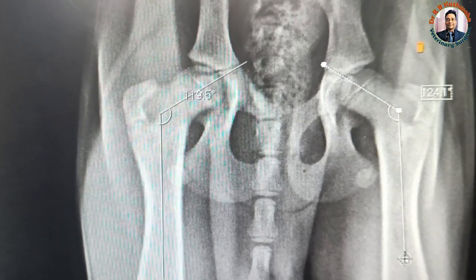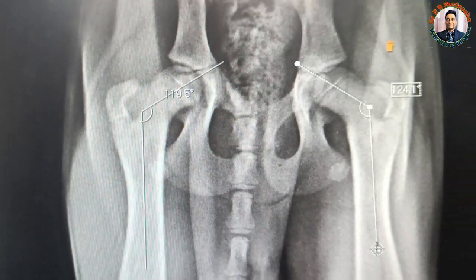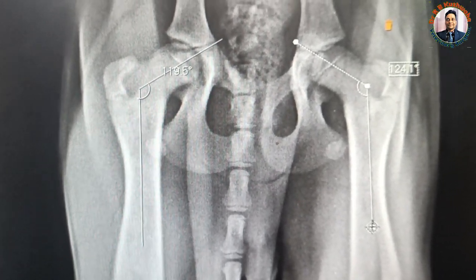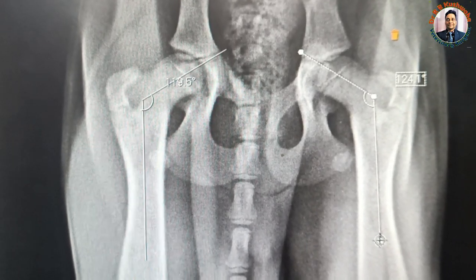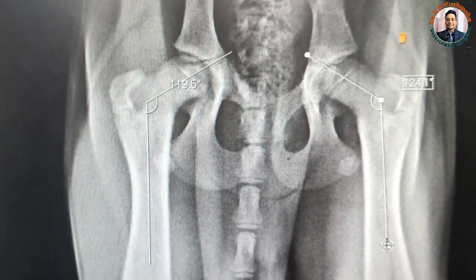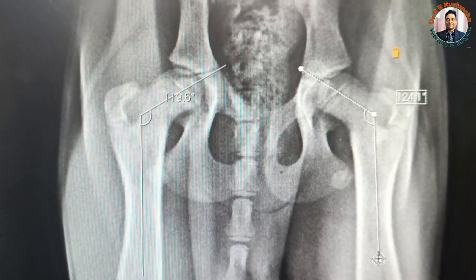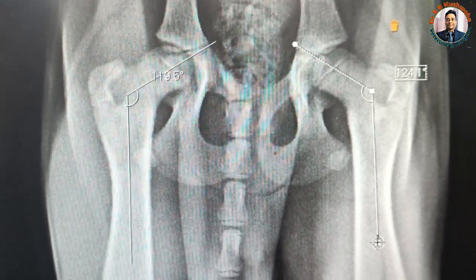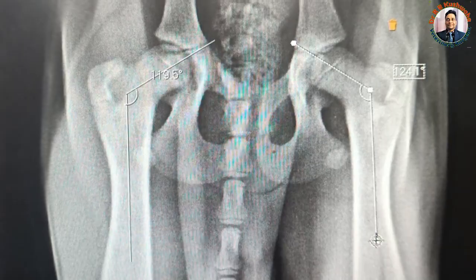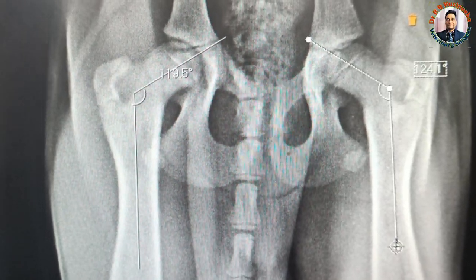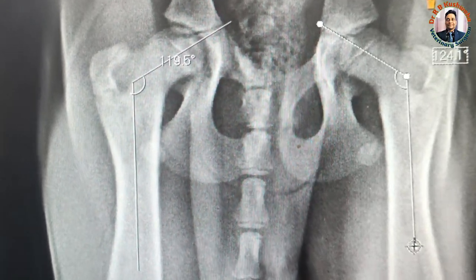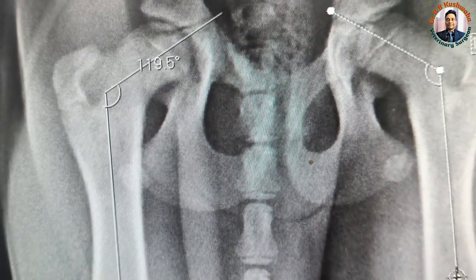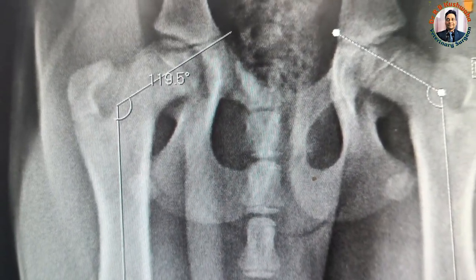Since this radiographic view is correct for this measurement, that's why I have chosen this particular radiograph — this is just to demonstrate how we take the femoral head neck and shaft angle. If this angle is more than 135 degrees, then we say it is coxa valga, and if the angle is less than 120 degrees, we say coxa vara.